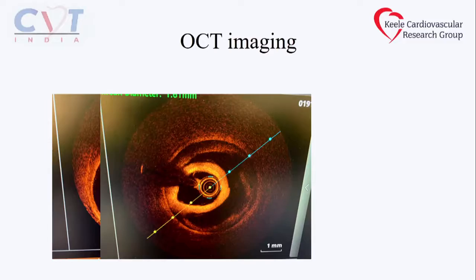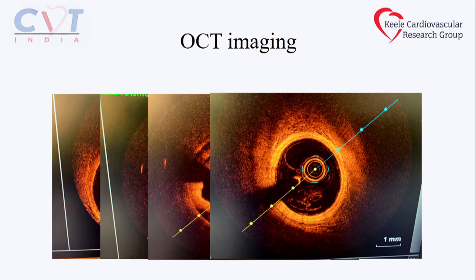Again, I OCT in 100% of cases or image in 100% of cases. And this is the OCT. So this is the proximal vessel. And the first thing to say is that you should be really suspicious when you have pristine looking coronary arteries proximally. This is at the level of the lesion. So this is a SCAD. So this patient had probably a vasculitis from his Hep B that had bled into the media, causing a SCAD presentation. And this is more distally. So this patient has a SCAD.